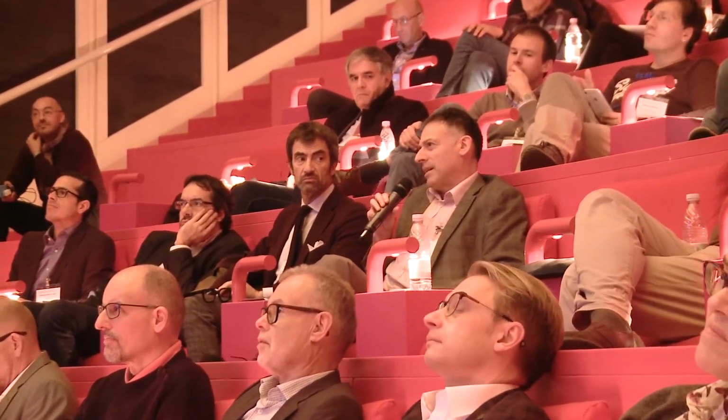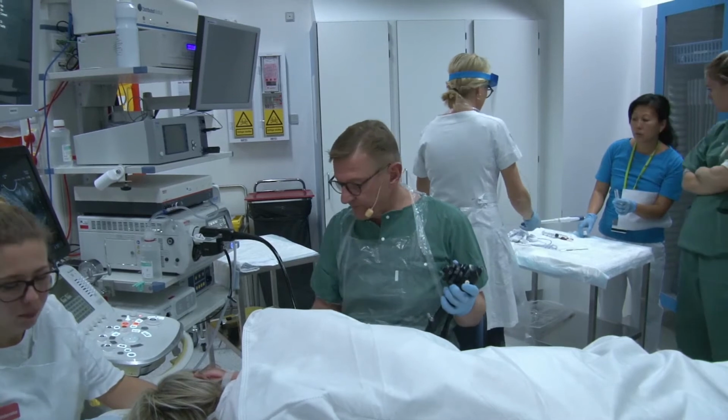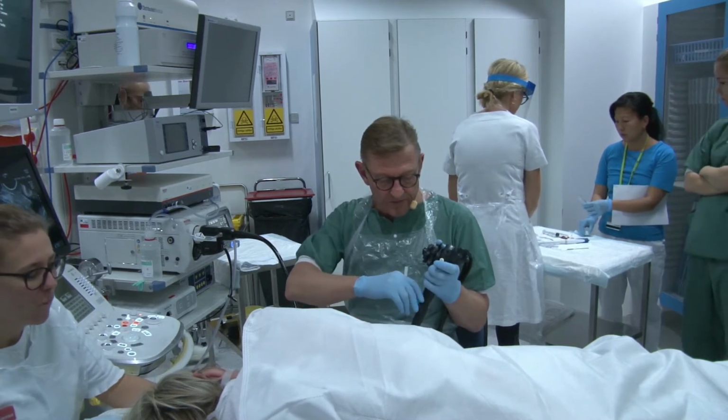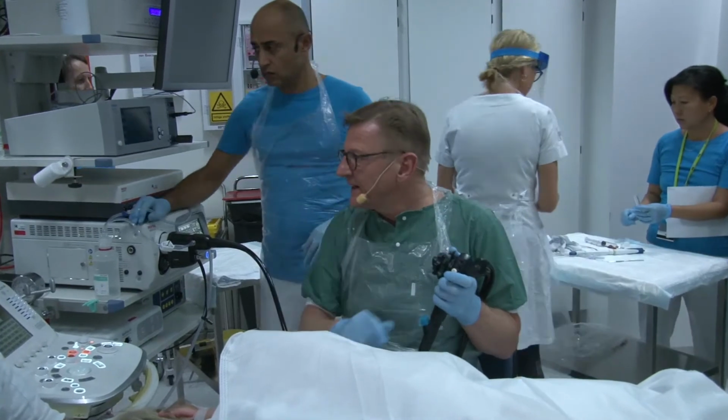Hi. Would it be technically possible to put a fiber optic scope down there and actually have a look inside? Yeah, that would be possible as well. There are cameras of that dimension. Because we also have CLE.